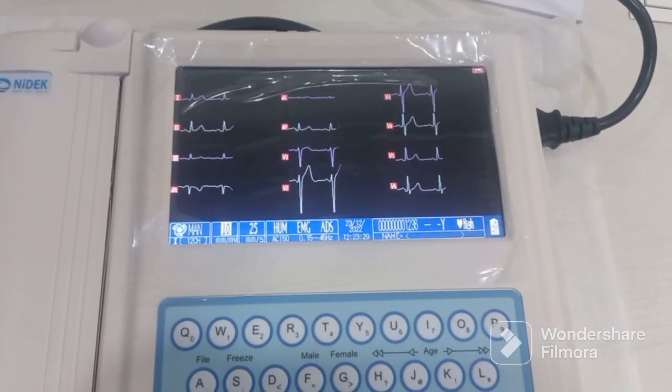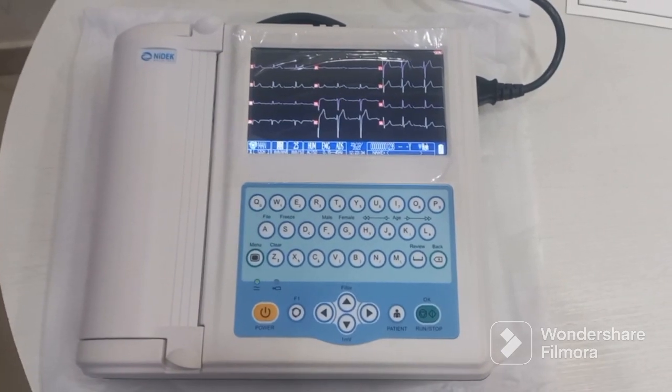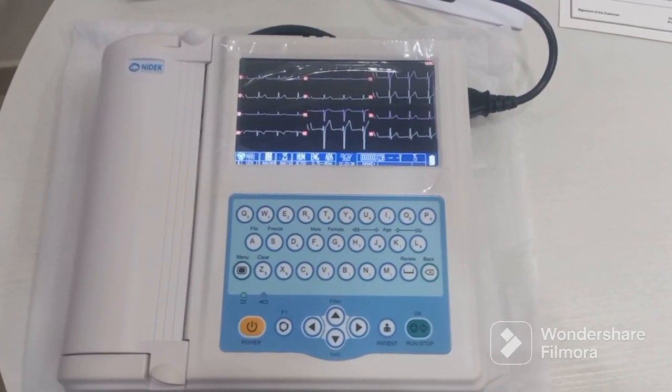This is a very simple-to-use machine — a 12-channel ECG machine from NIDEK, model 712. Thank you.